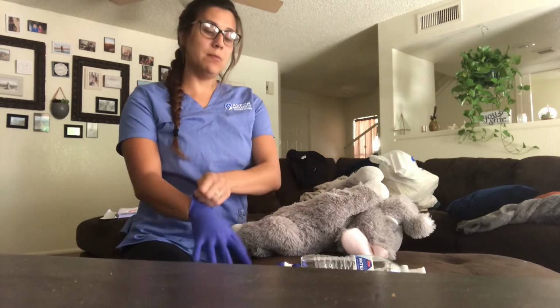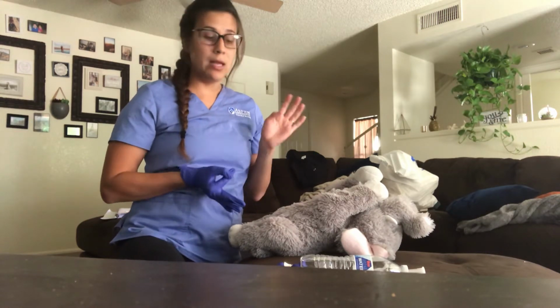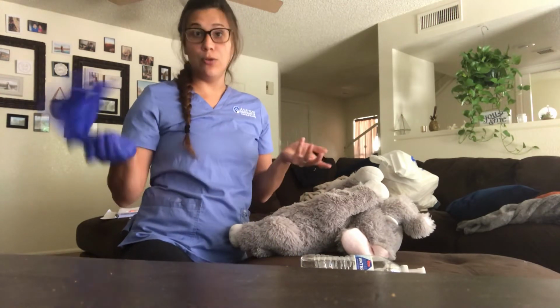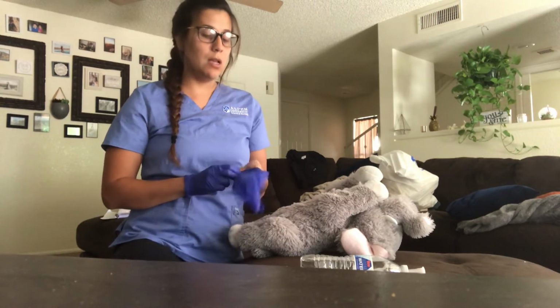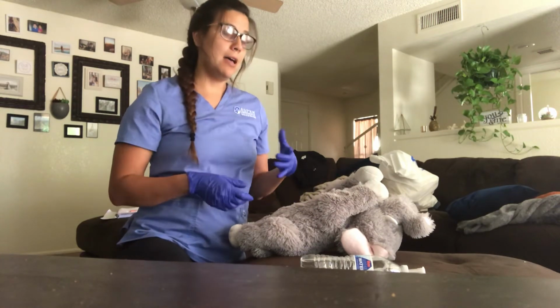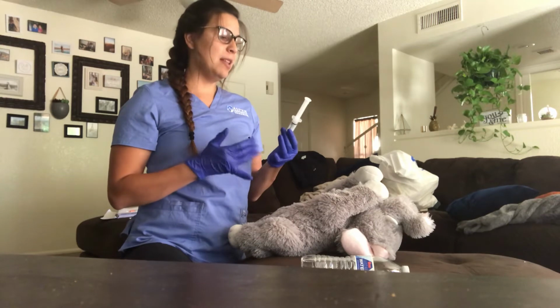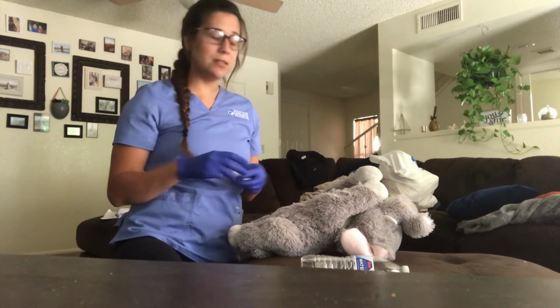So the placement can be checked through an x-ray, through measuring the length of the tube, and also through aspirating the contents in the tube. So we are going to do the one of aspirating it because it's the one that's most commonly used, especially in hospitals. So when you aspirate about 5 to 10 milliliters, you just pull it out when you connect your syringe in, and it should be like tan, green, off-white. Those are super normal colors.